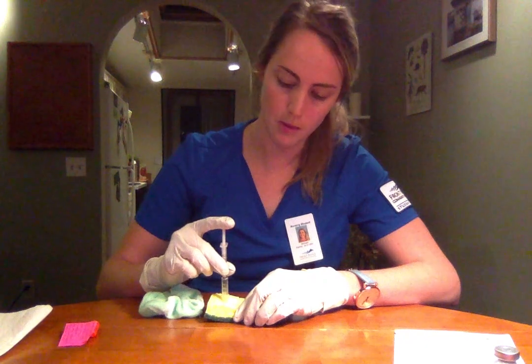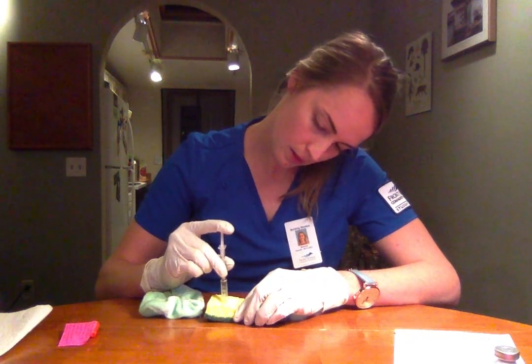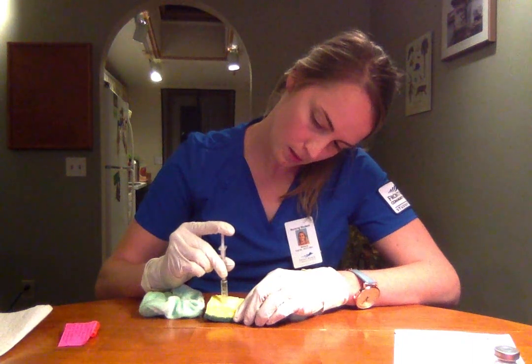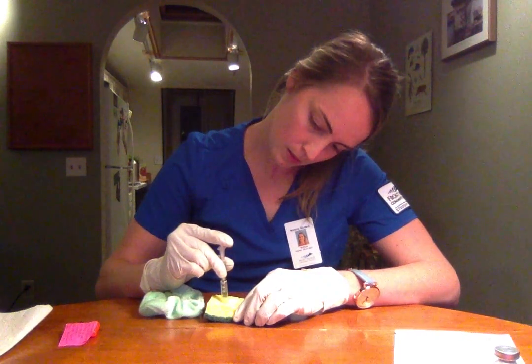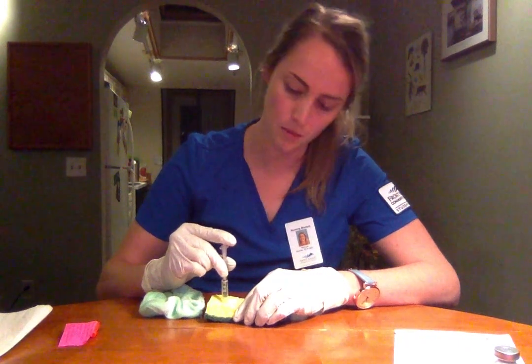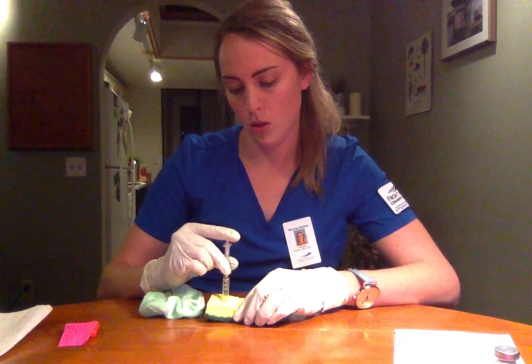I'm going to inject the medication slowly. Okay, I'm going to hold for 5 seconds. 5, 4, 3, 2, 1.